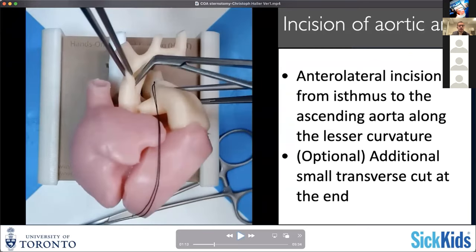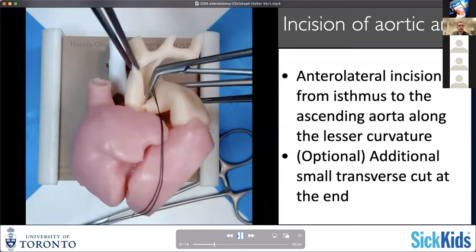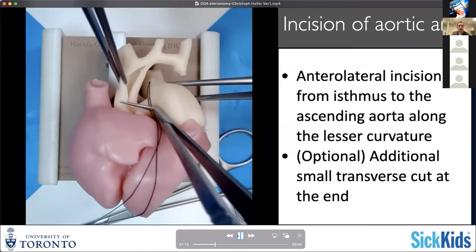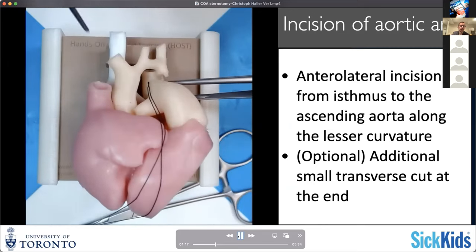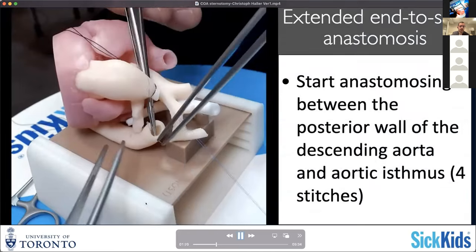You have to make sure that you're basically following the aortic arch appropriately. One mistake you could make is to be tricked into making this incision too short, because you think that your augmentation only needs to cover the aortic arch itself and the ascending aorta is already looking fairly decent in size. While that may be true, you surely want to augment far into a segment that is healthy and adequately large to ensure you're not leaving obstruction. Usually you have to go a bit deeper into your ascending aorta than you would initially think.